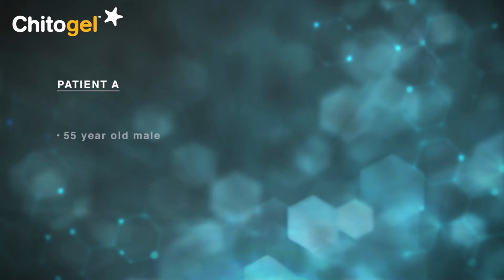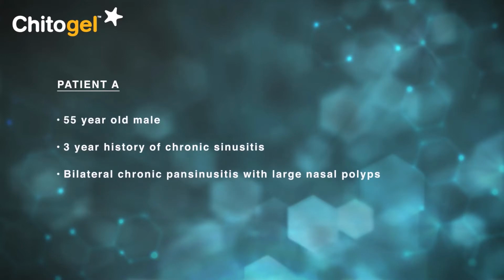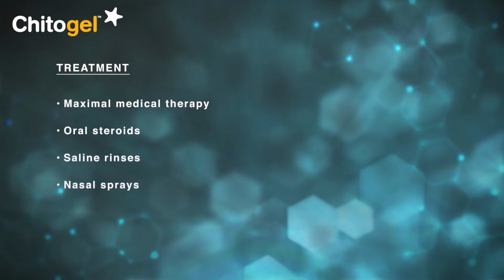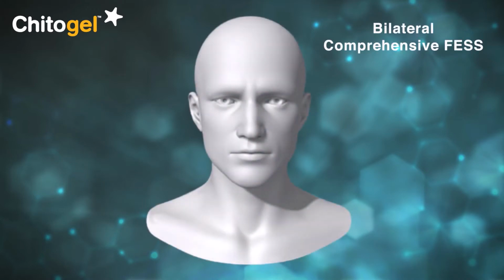Patient A is a 55-year-old male with a 3-year history of chronic sinusitis. This patient has bilateral significant sinus disease. His CT scan showed bilateral ongoing pansinusitis with large nasal polyps. He was treated with maximal medical therapy, including oral steroids, saline rinses, and nasal sprays, and showed no improvement in symptoms or on endoscopy. I'm going to perform a bilateral full house FESS.